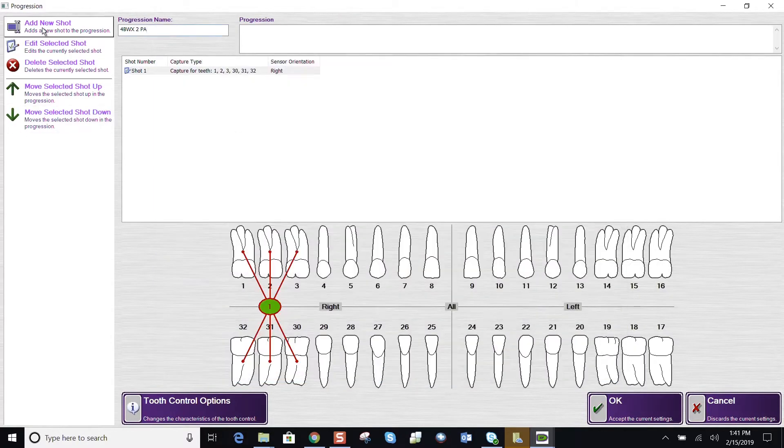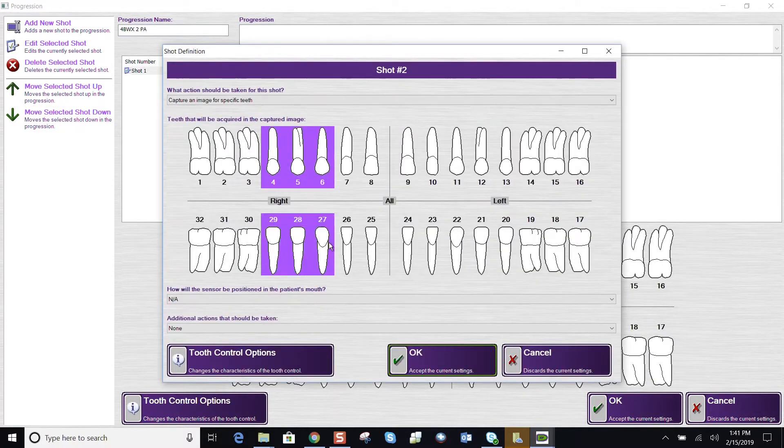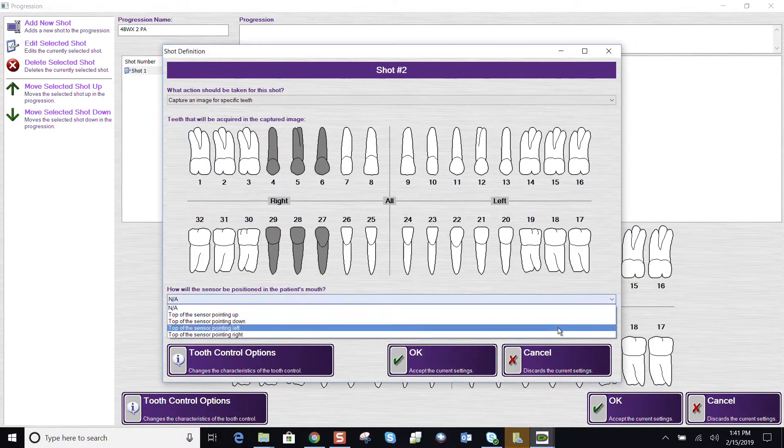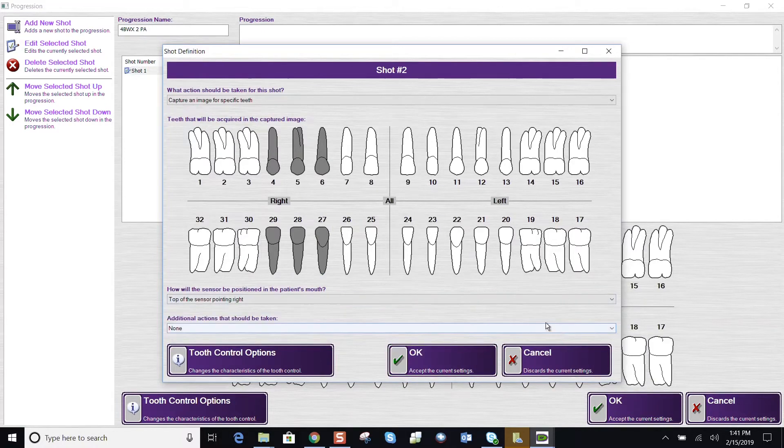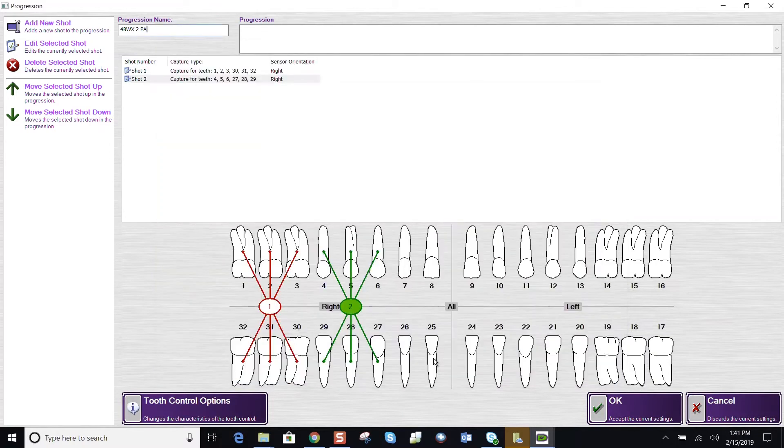Upper left-hand corner, add another shot. Let's highlight the teeth that will be in this image. Sensor orientation to the right, since it is the patient's right side. And say OK.